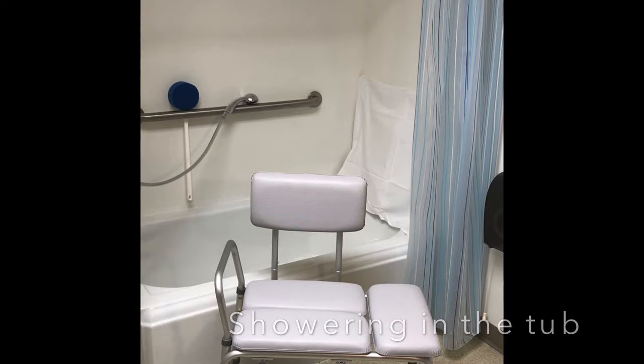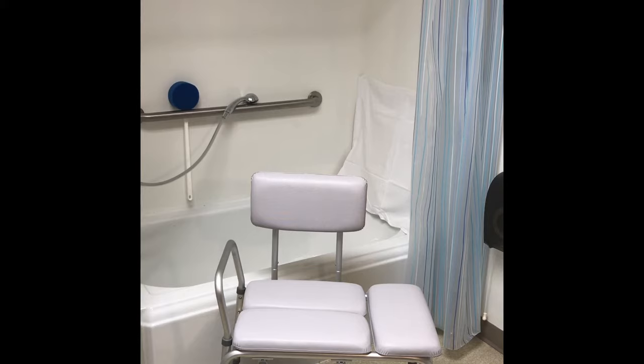We recommend using a tub transfer bench to get in a tub after a hip replacement to avoid bending or twisting your hip. If you do not have a tub transfer bench, you can sponge bathe while sitting by the sink. A tub transfer bench may also be helpful for safety after a knee replacement, as you are at risk for falling.